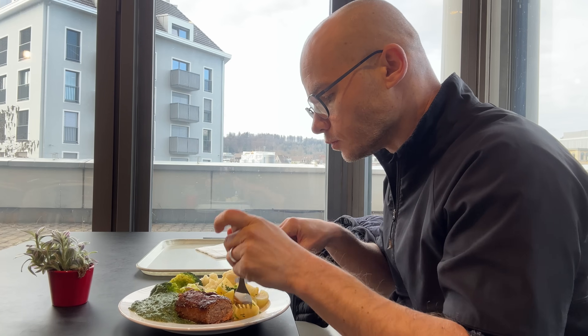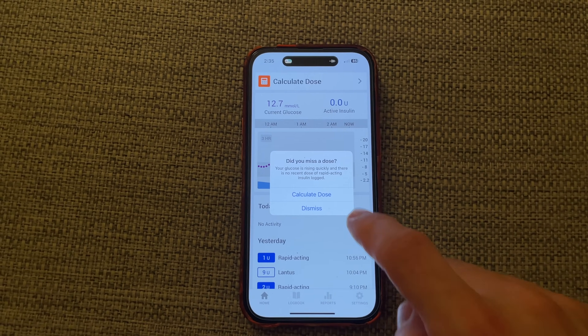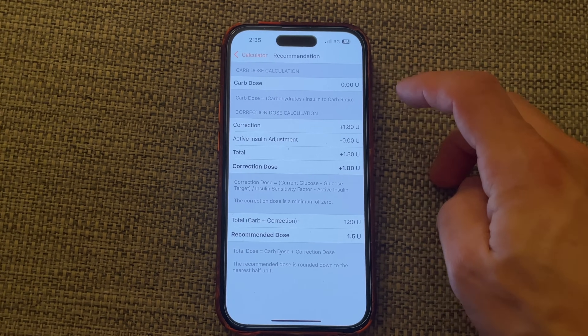Feature number 5: do you ever sit down, enjoy a meal, and an hour later check your CGM only to see your glucose sky high because you forgot to take insulin? Forgetting to bolus and seeing sugar in the 300s is one of the most annoying things about diabetes. But the smart MDI system can help — whenever the app sees that my glucose started to rise but I didn't take any insulin dose, it will notify me. If I missed an insulin dose, the app can help calculate the dose I missed so I can take the insulin right away.